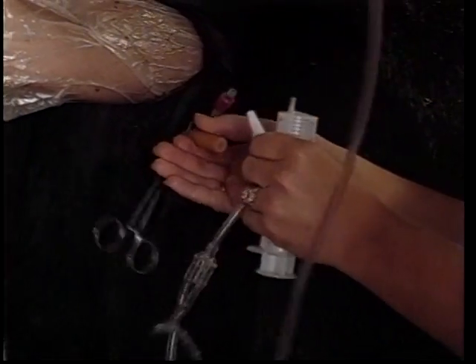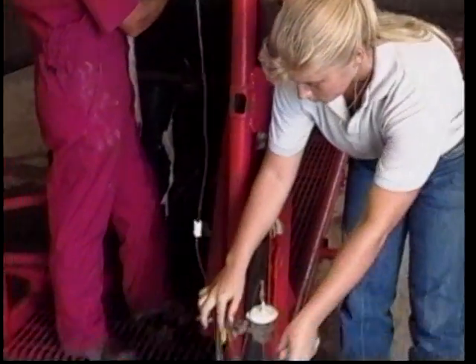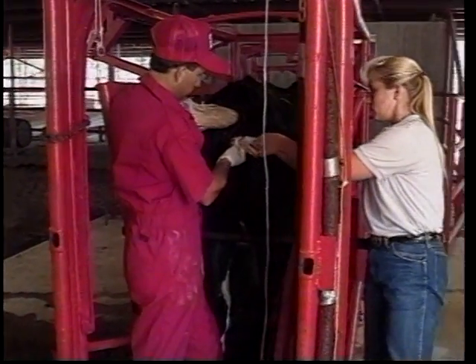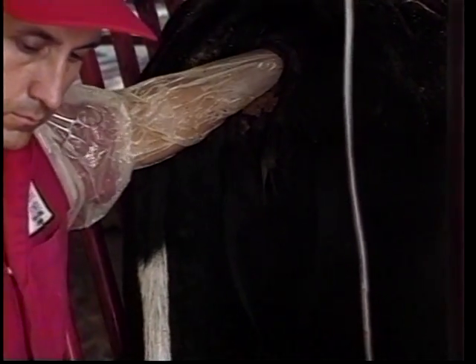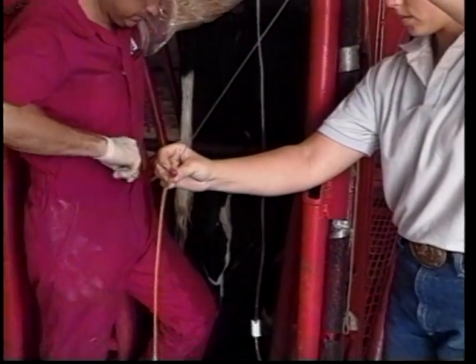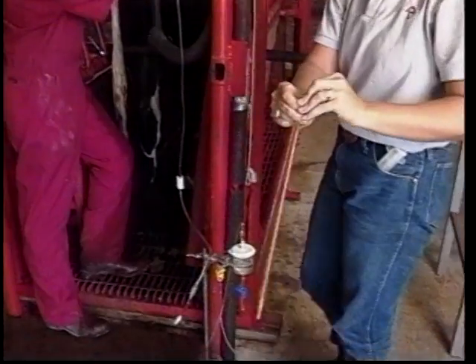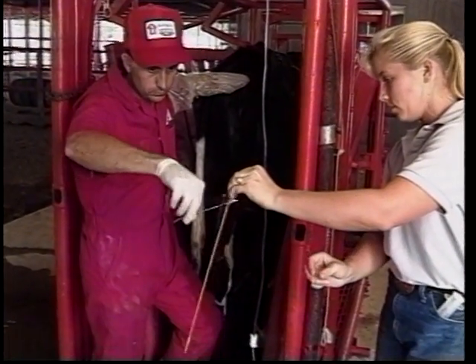After we complete flushing on the right uterine horn, the tubing will be removed and capped back off. The air will be removed from the balloon, and the catheter will be retracted from the reproductive tract. Care should be taken that sterility of the catheter is maintained at all times. The stylet is clamped back into position in the catheter.